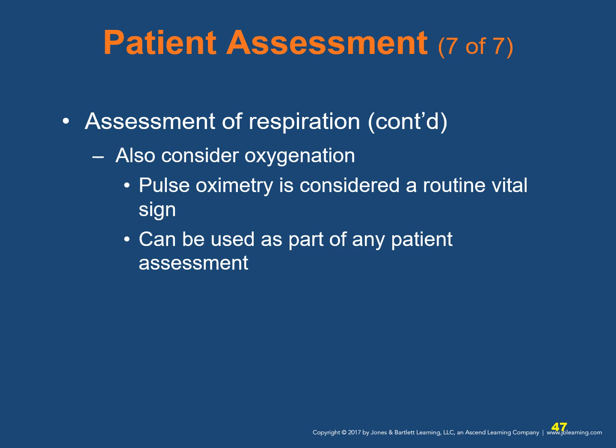When assessing patients, consider proper oxygenation, which can be assessed by pulse oximetry. Oxygen saturation, abbreviated SpO2, is a measure of the percentage of hemoglobin molecules that are bound in arterial blood. A pulse oximeter measures the percentage of hemoglobin saturation and should read 98 to 100% while breathing room air. Although no definitive threshold for normal values exists, an SpO2 level of less than 96% in a non-smoker can indicate hypoxemia.